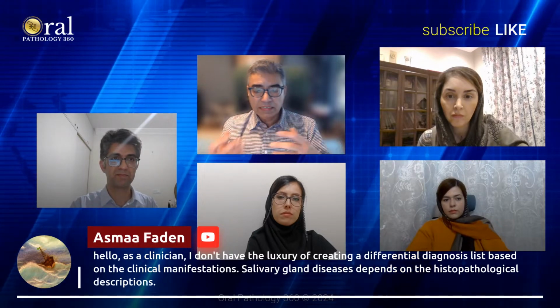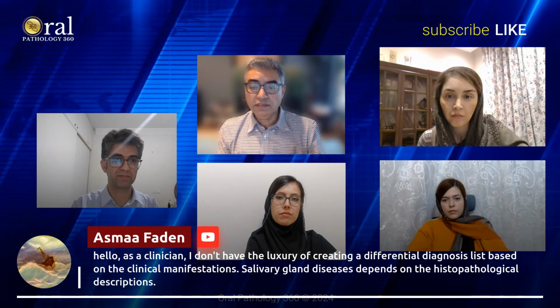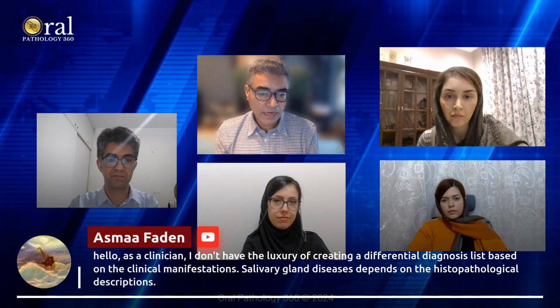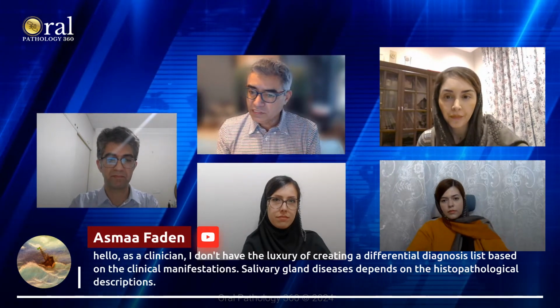And if the specimen is not matching that, it still can be a pleomorphic adenoma with a focal transformation to a malignancy. We have seen that, and that is still confined to the tumor. But the surgery doesn't change.